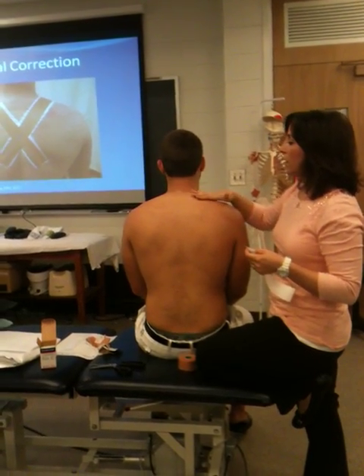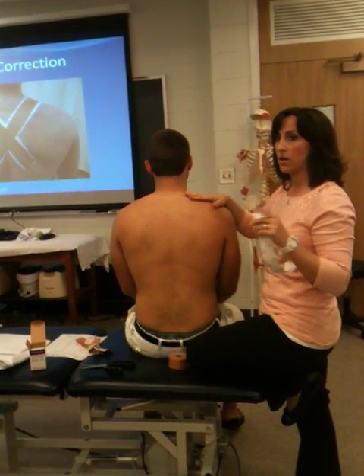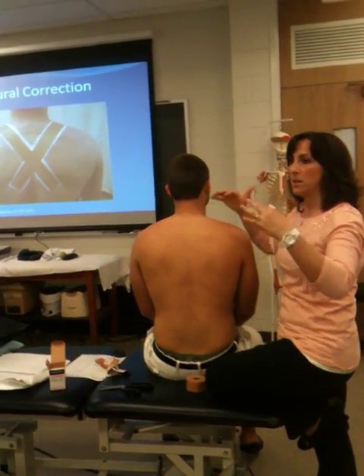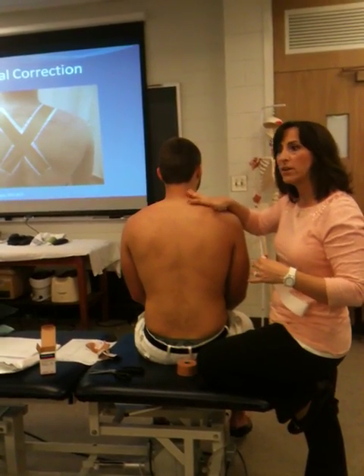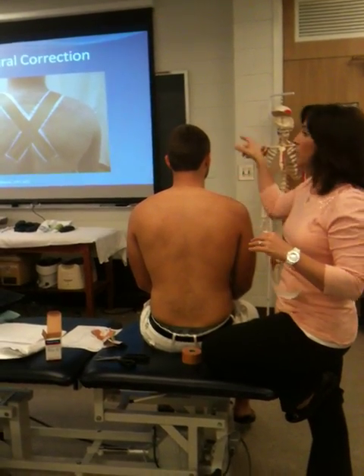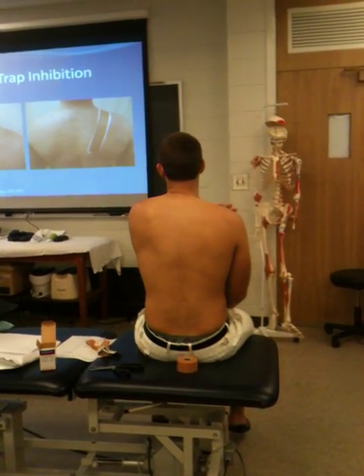You can try kinesio first. That can always be one of your first go-tos. But kinesio doesn't give a high dose of inhibition, right? It gives more of a gentle inhibition and an awareness for the muscle and the fascia to relax. If you tried that and it didn't work, then you can always go to the upper trap inhibition.